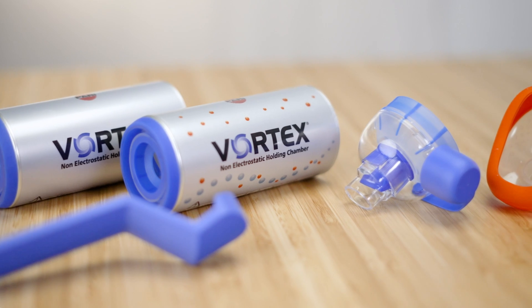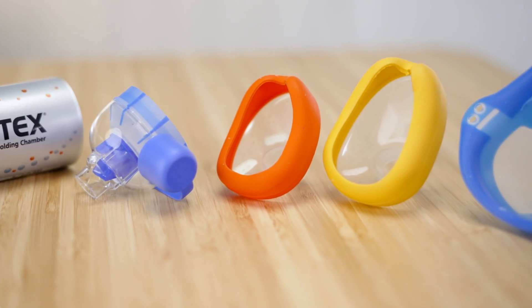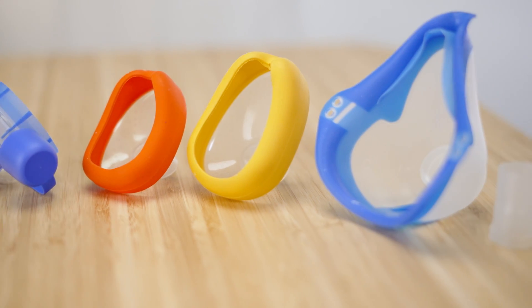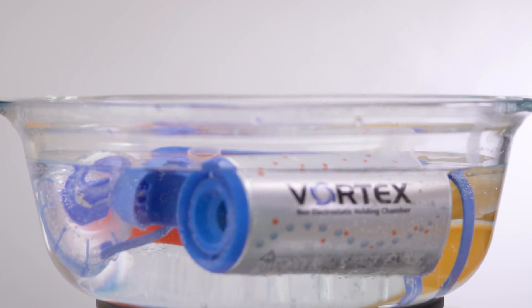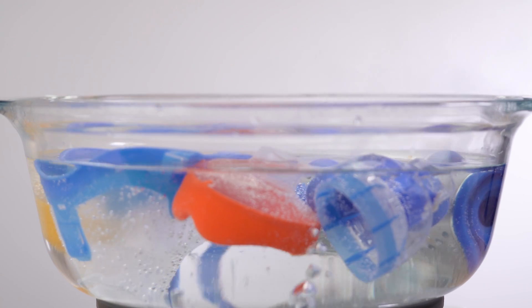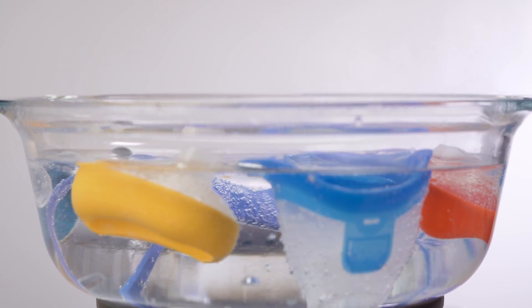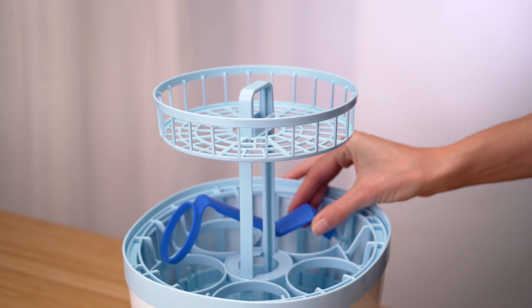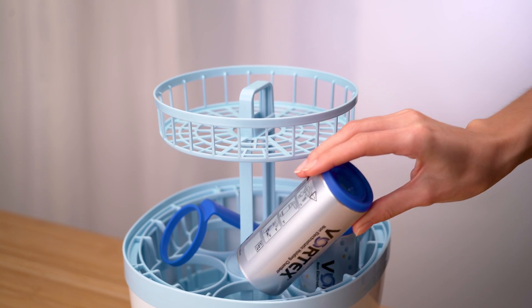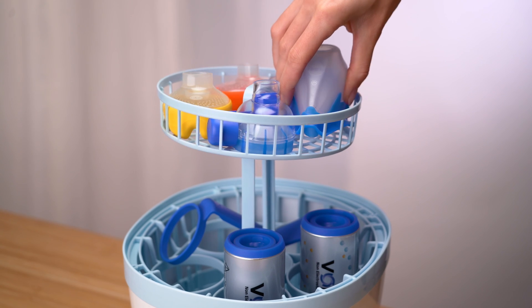Disinfect the Vortex after cleaning. There are two options available for disinfection. To disinfect with boiling water, you will need a clean pot and tap water. The plastic parts must not touch the base or sides of the pot, as the plastic may otherwise melt. Alternatively, they may be disinfected with a standard thermal disinfector for baby bottles.